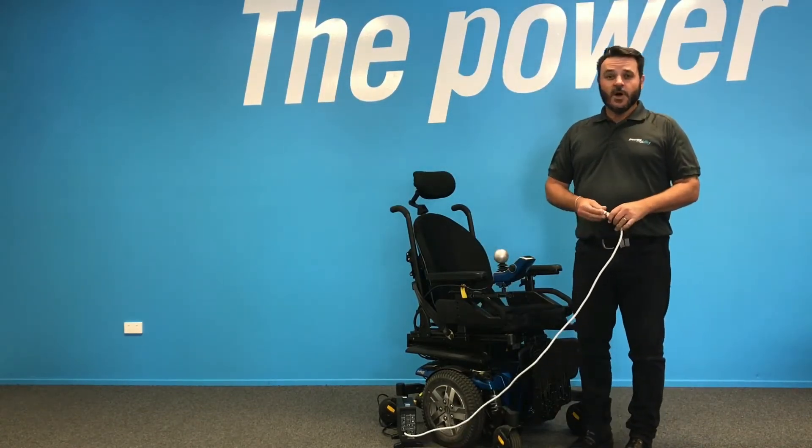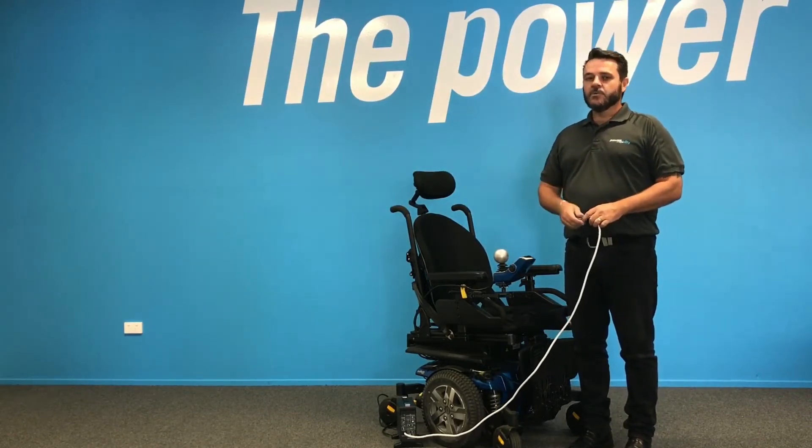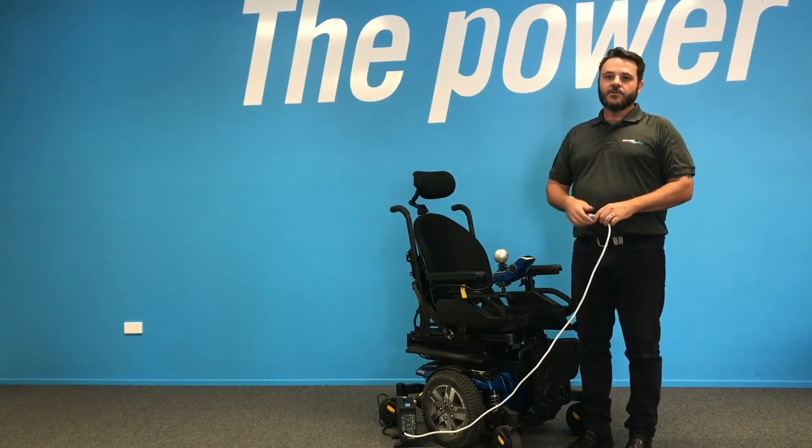Charging your batteries should be done every night. It's a good habit to get into — plug it in, flick it on at the wall before you go to bed, and then turn it off when you get up in the morning.